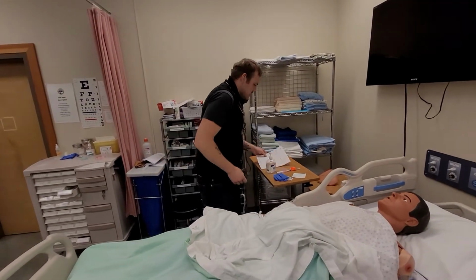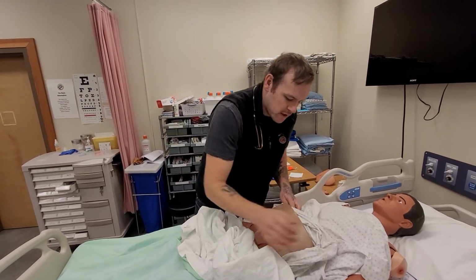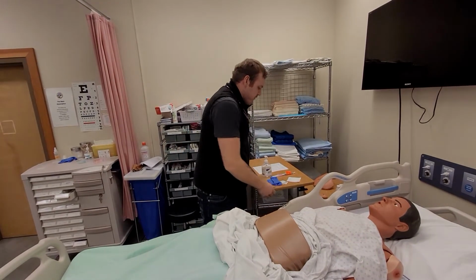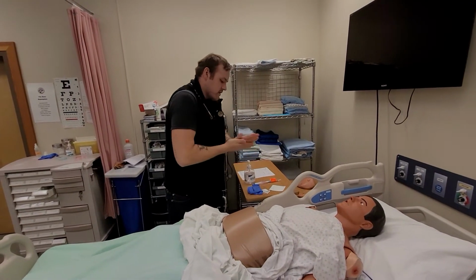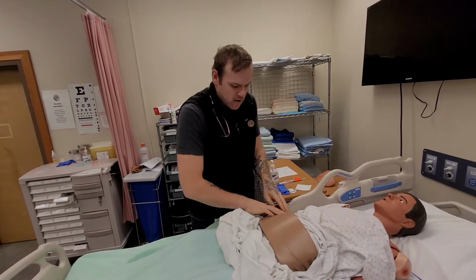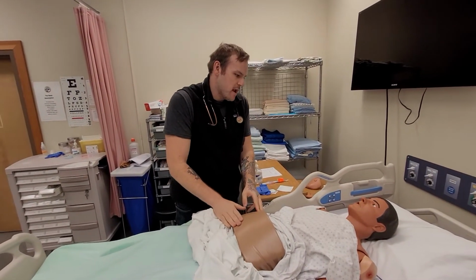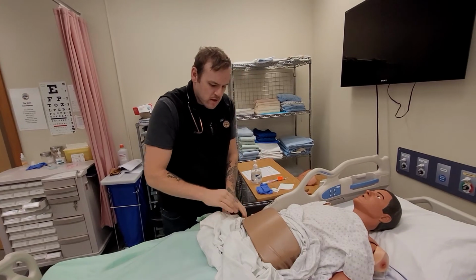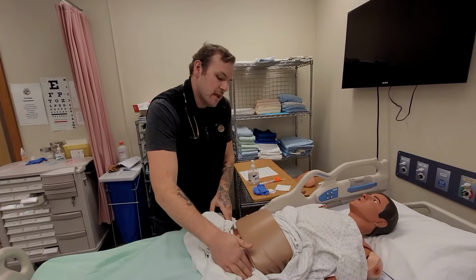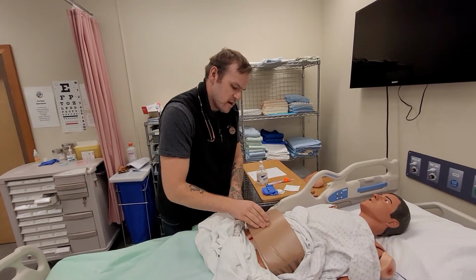Awesome. Okay, so we're going to assess our site here. I see that you have some subcutaneous fat on your abdomen, so that will be perfect for us. So first things first, I'm just going to perform hand hygiene. And I'm just going to palpate the area to make sure that there's no obvious masses or discomfort when I palpate. Nope. Perfect.